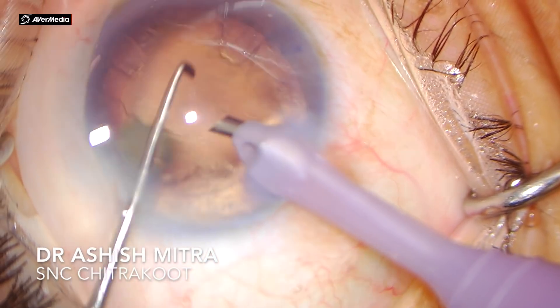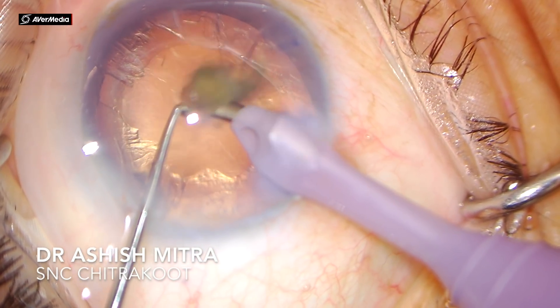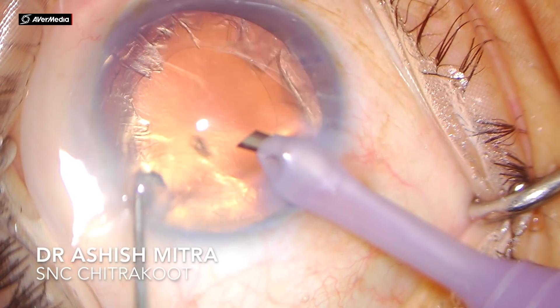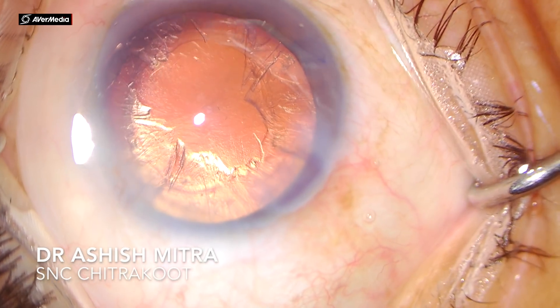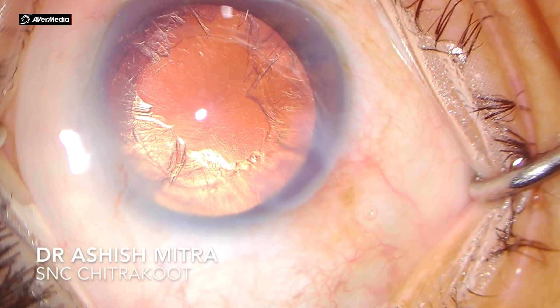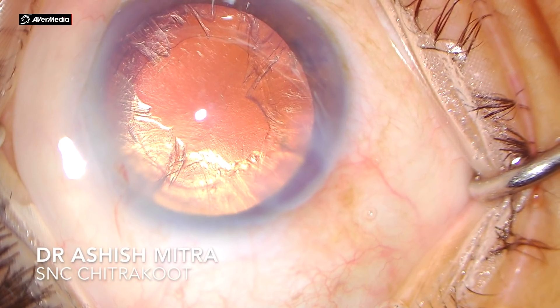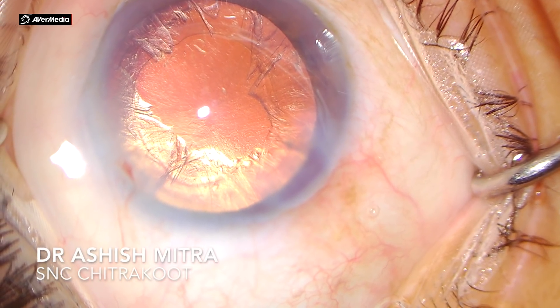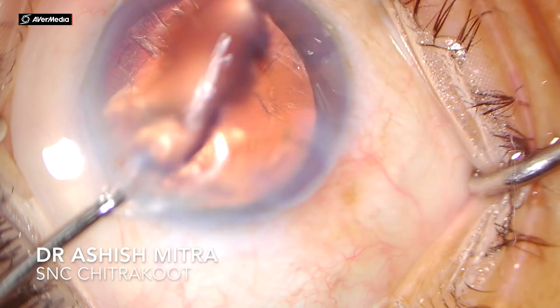When you have made 3 to 4 or maybe 6 pieces, they are very soft and easy to emulsify. As you can see, this is a totally unedited video. As I highlight in all my previous videos, if you do all steps of the surgery carefully and slowly, the surgery is still very fast — total duration is less than 5 minutes.